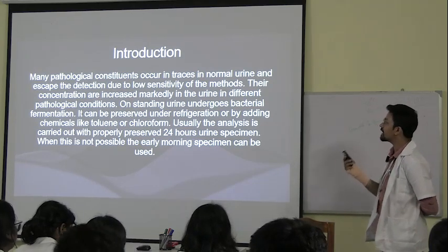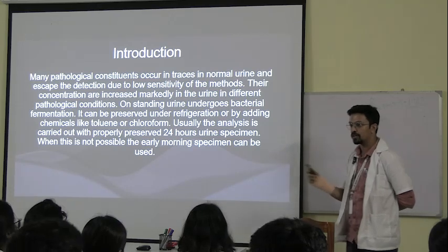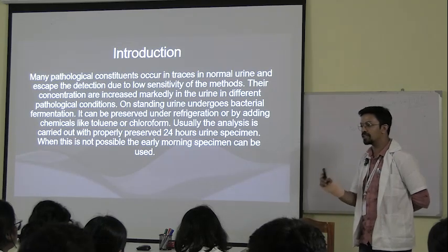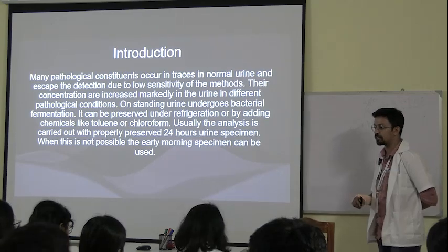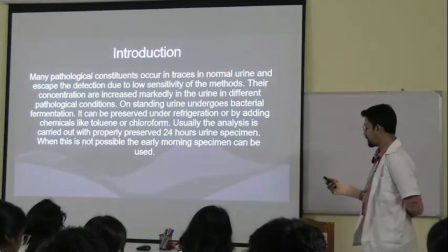You might be thinking, why low sensitivity? What is the meaning of it? The meaning of low sensitivity is that the test tells you the sample has reducing sugar, but if the test is coming negative, it doesn't mean it doesn't have reducing sugar. It can have it, but the amount is so small that the test is coming negative.